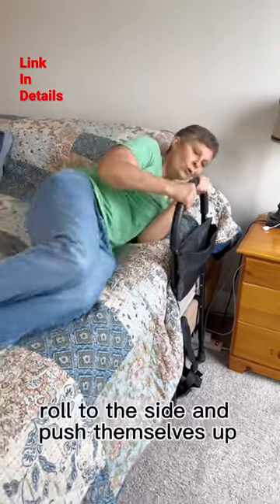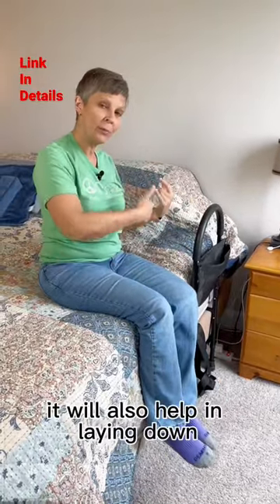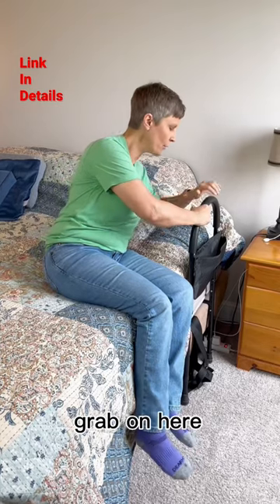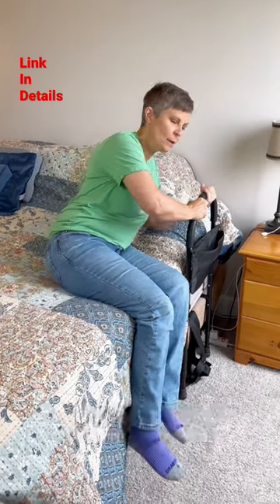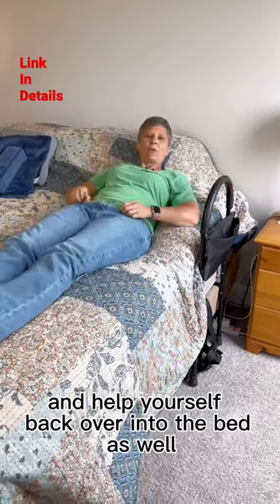This is going to help roll to the side and push themselves up. It will also help in laying down. You can put this elbow down and grab on here, or you can grab on with both hands. You're going to come down on your side and help yourself back over into the bed as well.